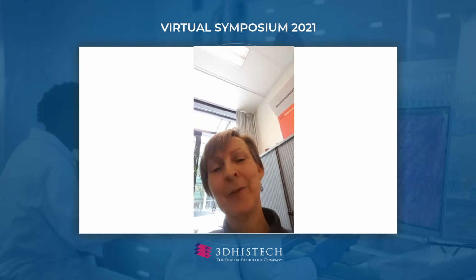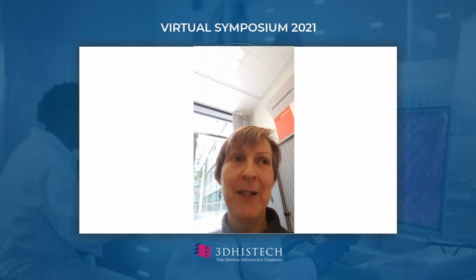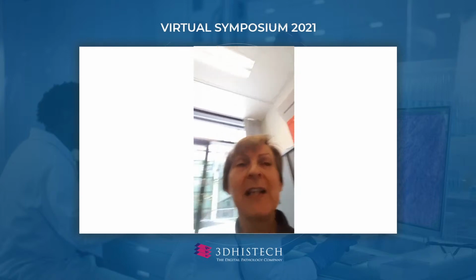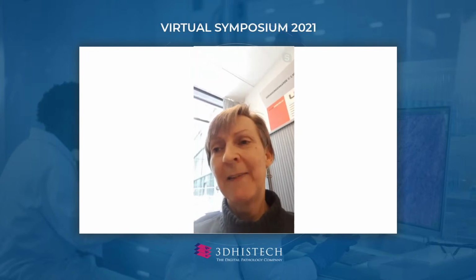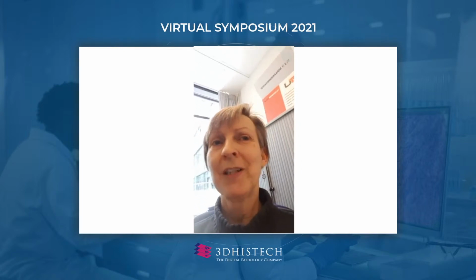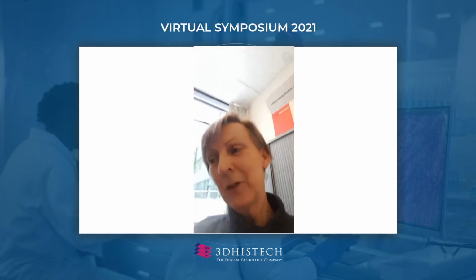Although it's a difficult question. We always discuss with our technicians that do the quality check, because even many slides that are out of focus in a little area, you can really very well use for your diagnostics. So that's no problem. But quite often the technicians don't know exactly what we are looking at. So they tended to reject, at least in the beginning, a lot of slides because they were afraid that otherwise we couldn't do our job.